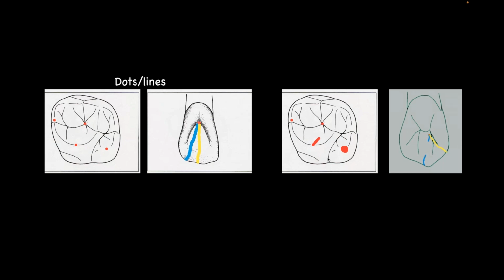So that's why in my lab, we try to really spend our time not only checking it from a basic point of view and opening and closing, but maybe squeezing those models together and working through the friction aspects to make sure that we're not going to give the doctor back something that looks like this when they're done and they have to now harness it.